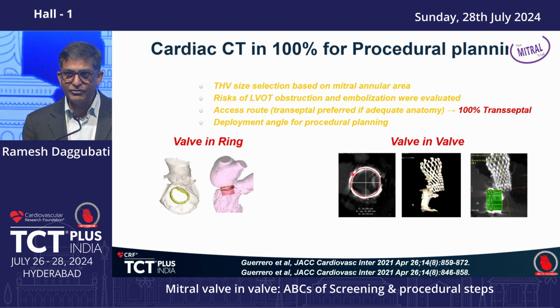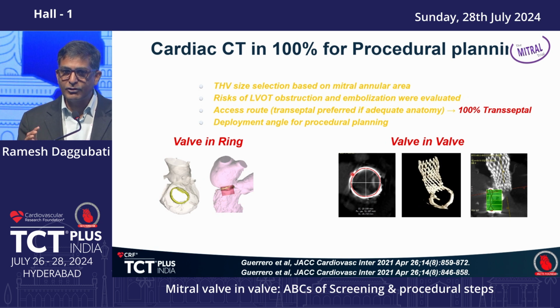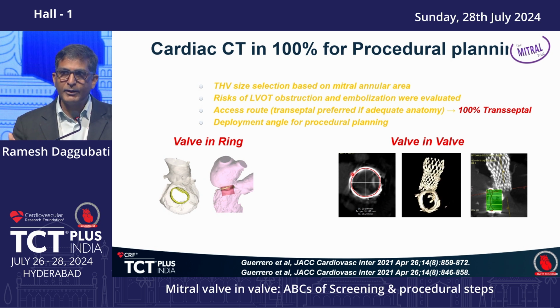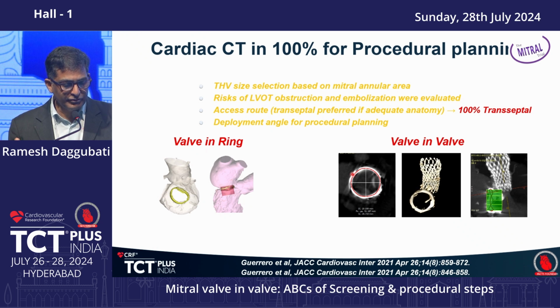Right heart catheterization is indicated, and looking at right ventricular function is also very important in these patients, because even though we think the mitral valve is the problem, these patients might be admitted to our institution a day or 2 days early to tune them up with diuretics or low-dose dobutamine to improve the right ventricular function. If PA systolic pressure is more than 70 millimeters on right heart cath, that is a poor predictor of outcomes in these patients. That has been shown. And if they are oxygen dependent, those patients also don't do so well with mitral valve-in-valve procedures.